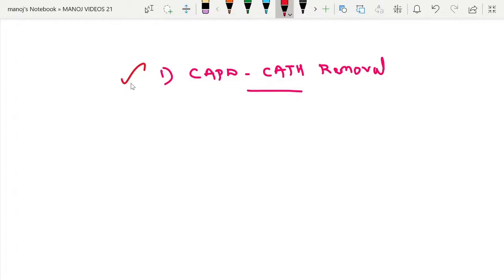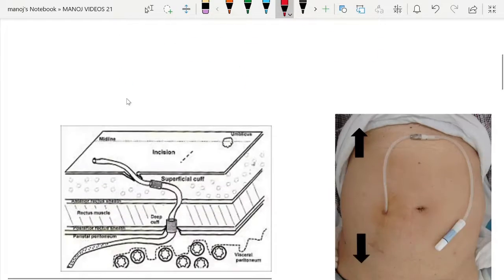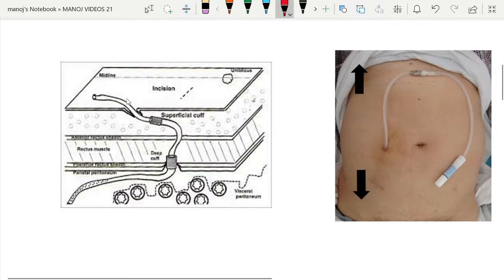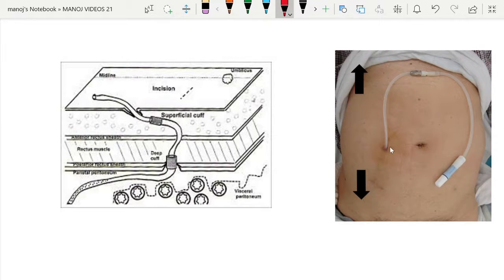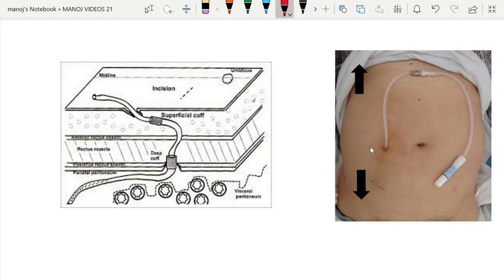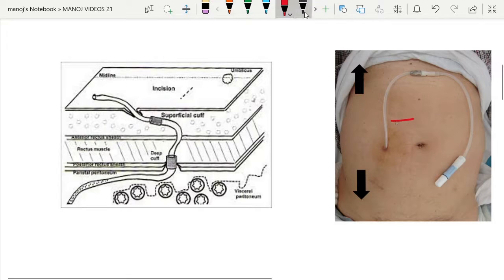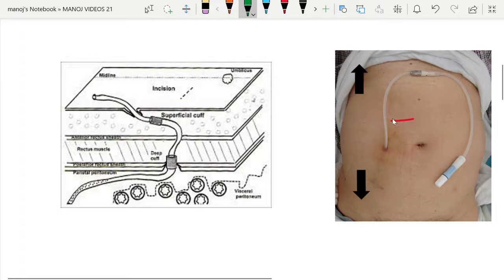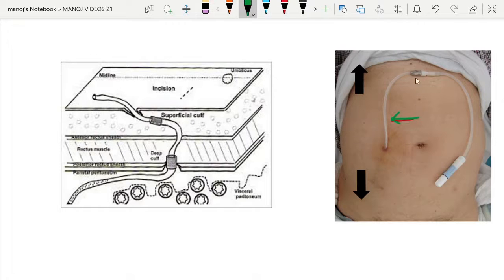Today we will see the steps of CAPD catheter removal. This is a CAPD in the patient. Regarding the parts of it, we will be discussing in a separate video. In gross, this is the catheter.